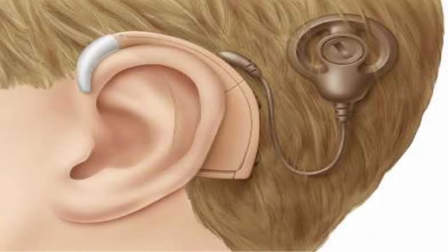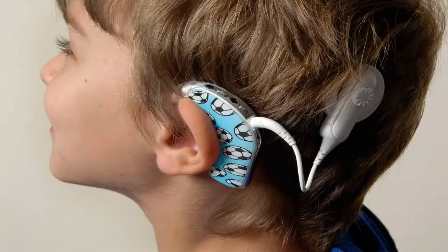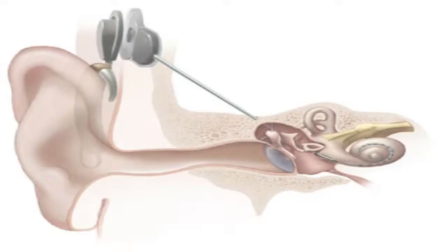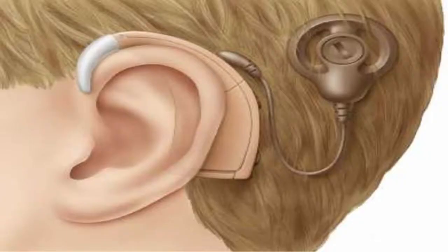A cochlear implant is different in that it has a microphone and a processor just like a hearing aid, but it creates a digital signal that's transmitted across the scalp to a coil that's implanted against the skull. The coil is then attached to an electrode which is implanted in the cochlea or the inner ear. And then what it does is it bypasses the hair cells and directly stimulates the nerve endings. So hearing aids stay in the ear and make things louder. The other one travels up and into the scalp.